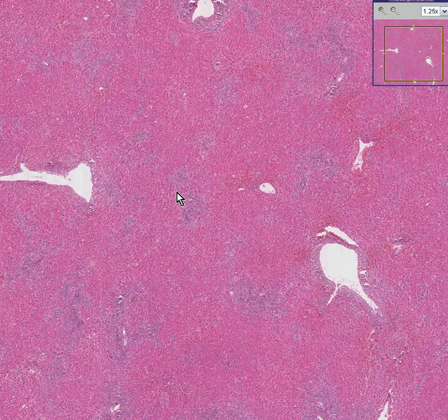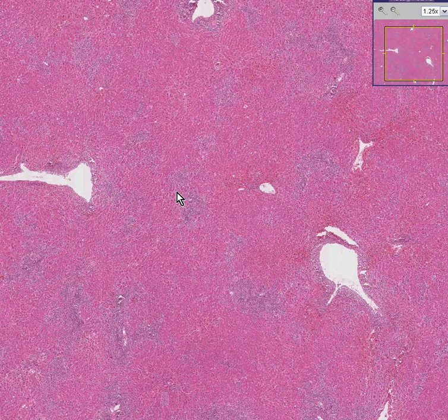There is an old saying among us old-time pathologists which we have always remembered: when a lymphoma metastasizes to the liver it frequently shows a periportal pattern of infiltrate. When a leukemia involves the liver extensively it frequently is around central veins and sinusoids.